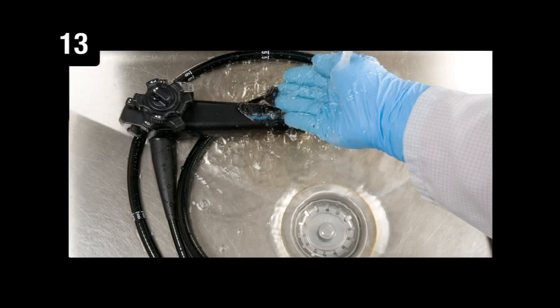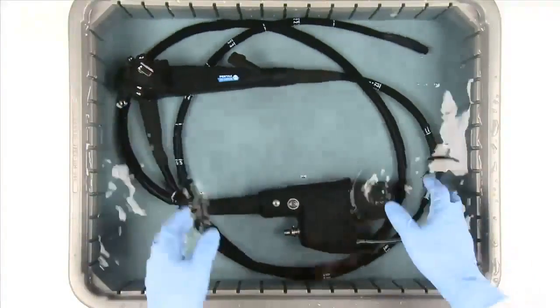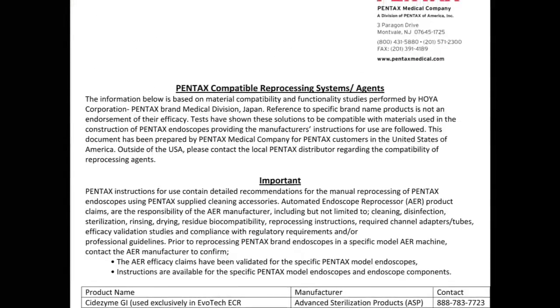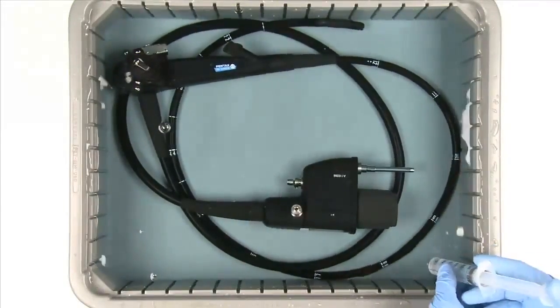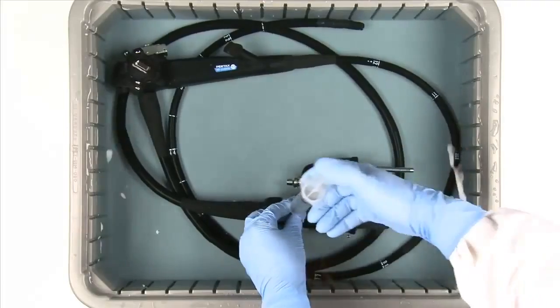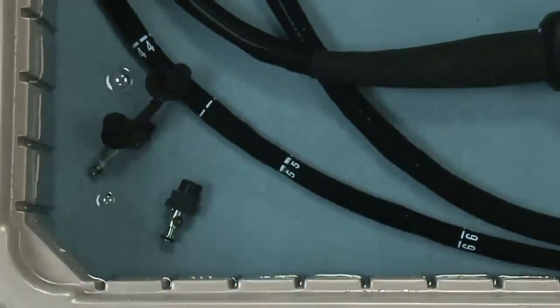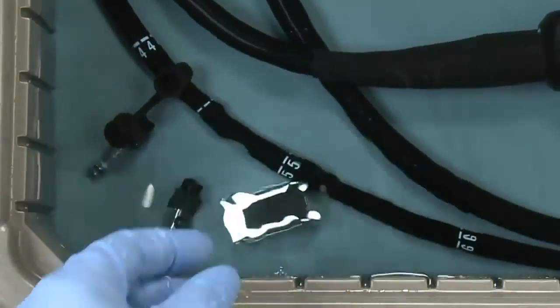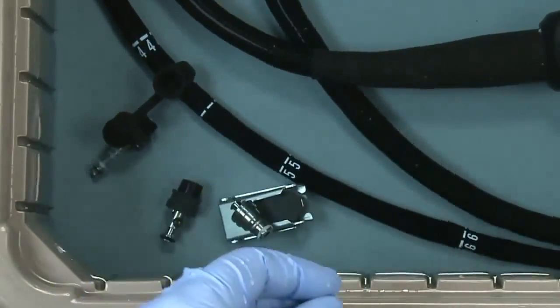Step 13. Perform manual high-level disinfection and rinse. Submerge the endoscope in high-level disinfectant, HLD. Refer to the PENTAX list of compatible reprocessing systems agents. Utilizing a 60 cc syringe, fill each channel with HLD until air bubbles no longer appear. Detach all cleaning adapters and place in the basin along with the syringe and allow the endoscope, adapters, and syringe to soak in accordance with HLD manufacturer's recommendations.